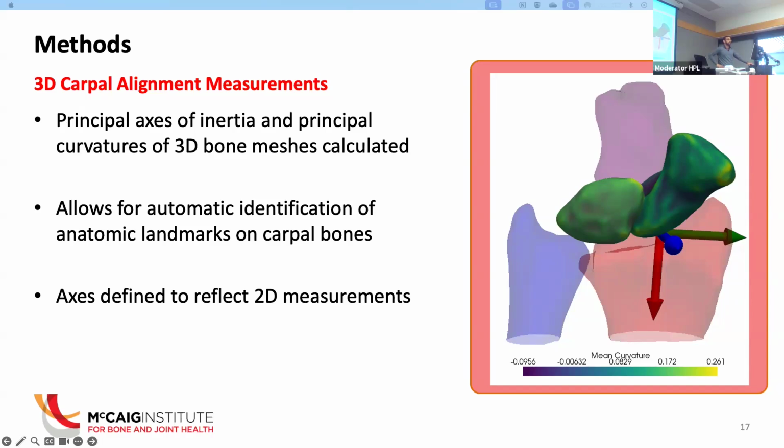You do a projection to mimic what an X-ray would look like. So you scroll through CT slices and you're going to be looking for specific anatomical landmarks as you go through these slices. The gold standard is doing it on a radiograph, where it is just like a maximum projection. But for this, just make sure that the wrist was in the same position, we use those CT slices.